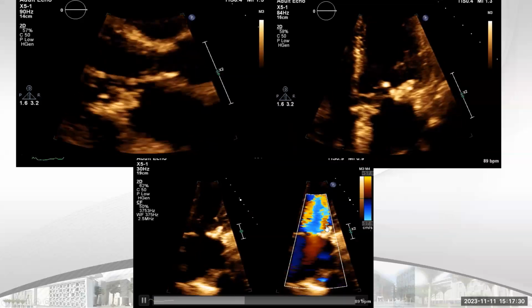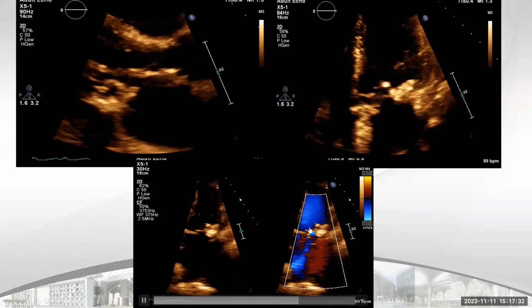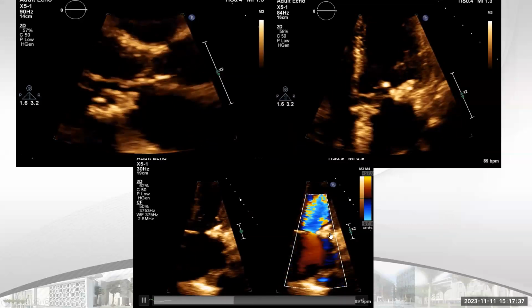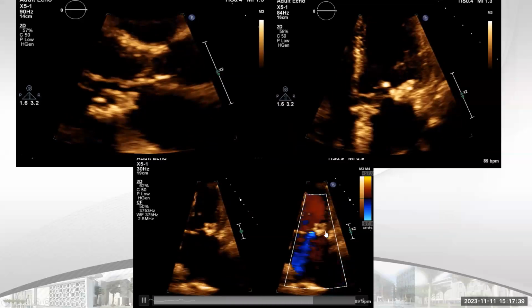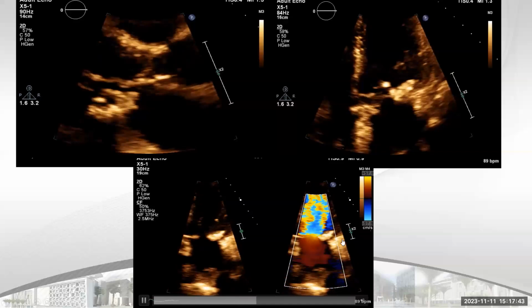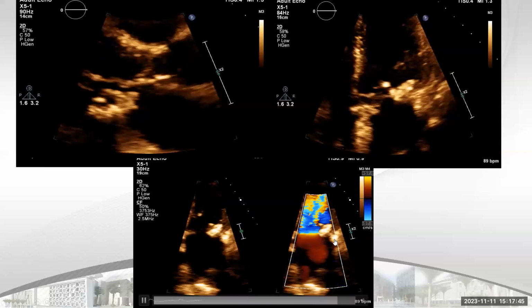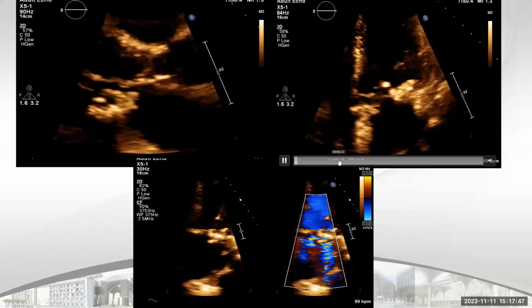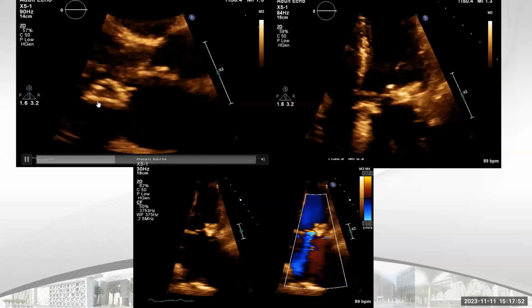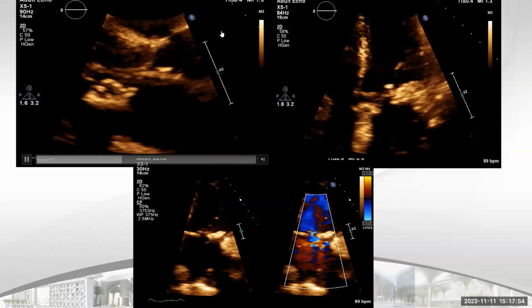Nice. And this is complicated by what? There is MR, that's right, but there is also what here? There is MR originating from the base of the leaflet, and this indicates perforation of the leaflet. So we have two MR jets. One is central, and one because of perforation. So consider a severe MR, and this is all our vegetation, and there is abscess. By the way, there is one coding of abscess in the coding system sheet.